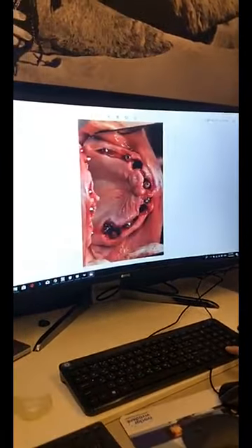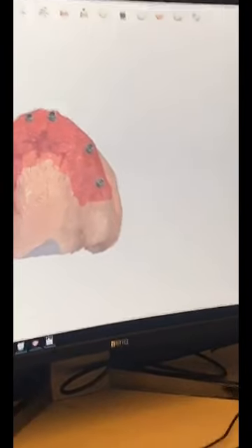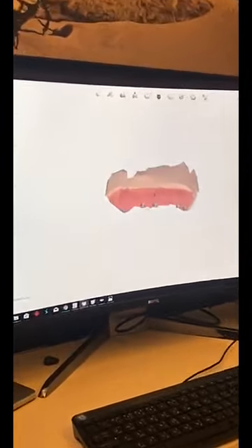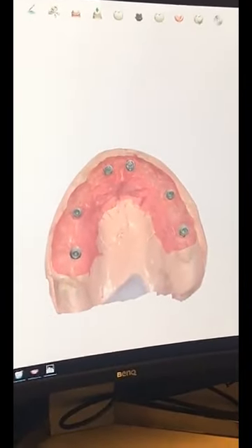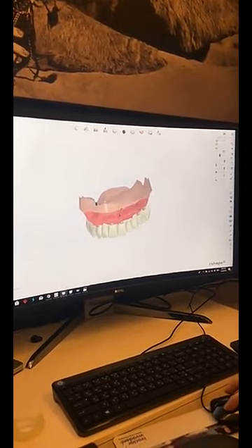The next step now is to wait for the healing to complete, and we took an impression for that case in the patient mouth digitally after the healing is completed via means of what we call the scan markers, and we will show them to you after a while.